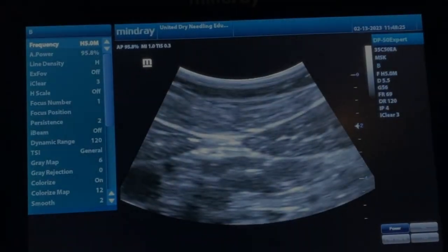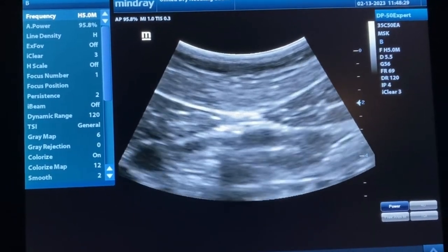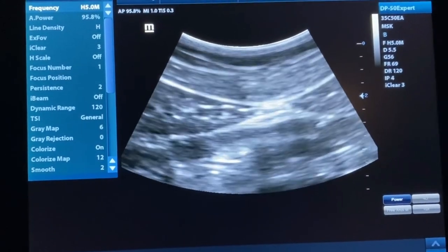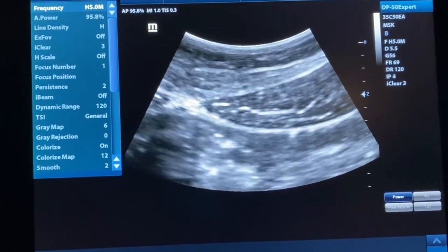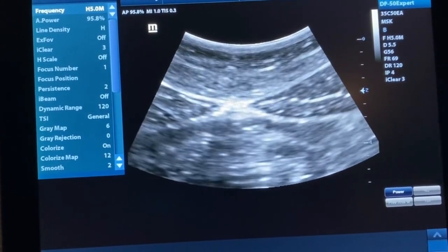Now we'll see another live scan. You can see the rectus head, the linea alba in the middle, and the other side of the rectus. Directly underneath those two rectus muscles is all that movement — that movement is the peristalsis of the bowel. That's the peritoneum, and that's why it's so important to know the depth when you're needling this particular muscle.